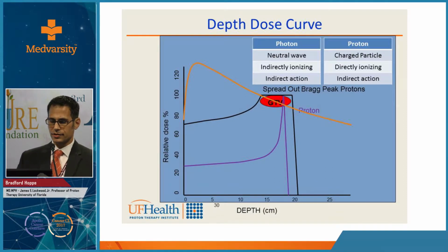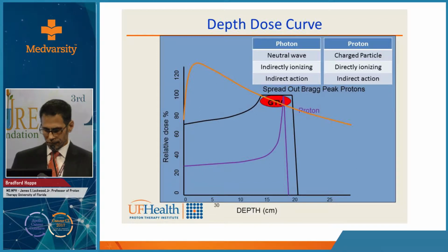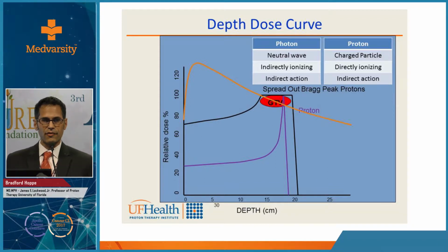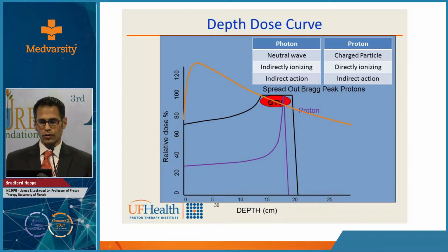Proton therapy is different. Protons are charged particles that have both mass and charge, and so they'll go a certain distance and then deliver all of their dose at that one depth. That's what you see here, this characteristic Bragg peak. You have a low entry dose and no exit dose. Now, most tumors are more than 1 millimeter in size, so this is not a very effective treatment if we just use it like this. But what we do is use the spread out Bragg peak, which allows us to treat the full extent of the tumor. We still have no exit dose, but you do have a higher entry dose when we do it that way.